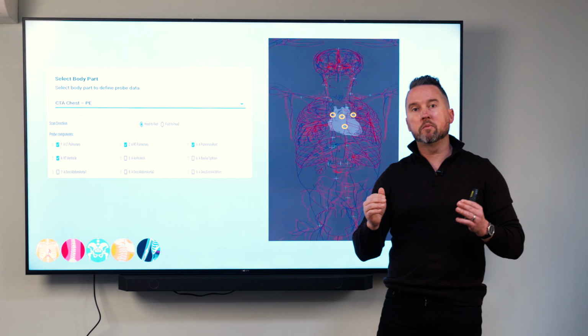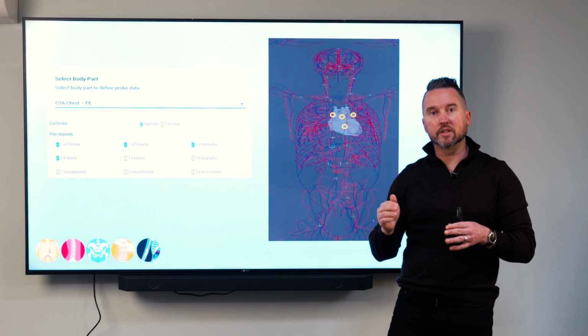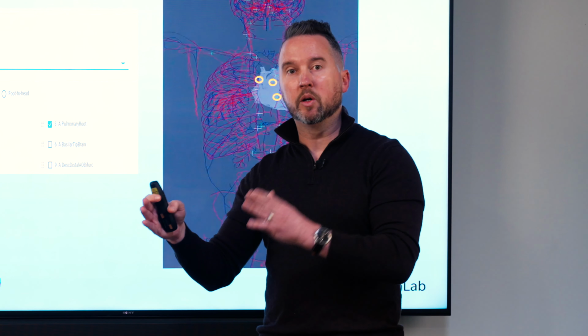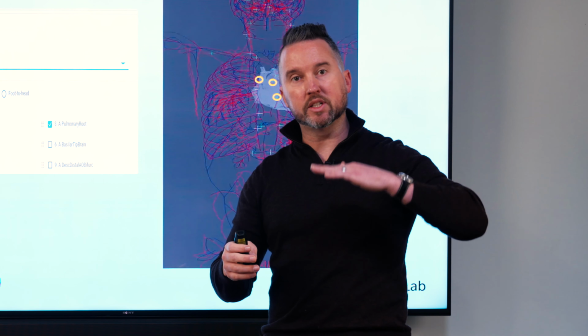So what we want to be able to do with quantitative angiography is to be able to tell you how many seconds you were too early, or how you were on time, or how many seconds that you were too late with regards to the timing of your actual image acquisition versus the contrast washing in to those areas of interest.